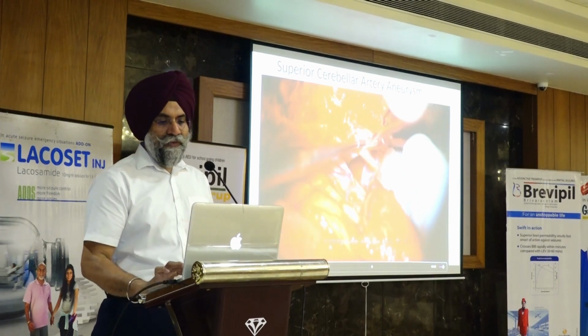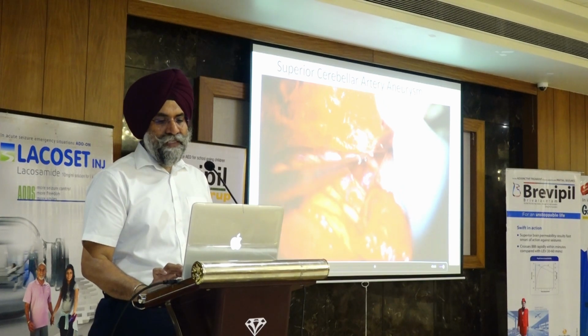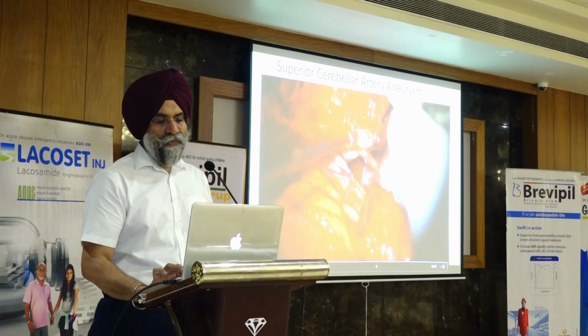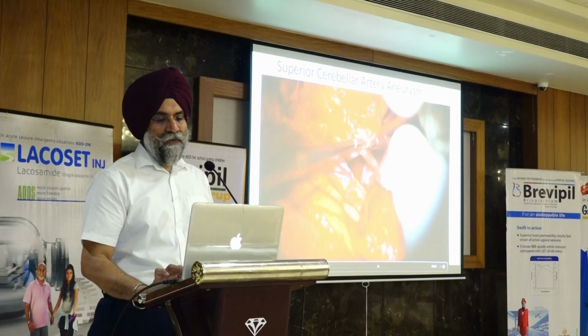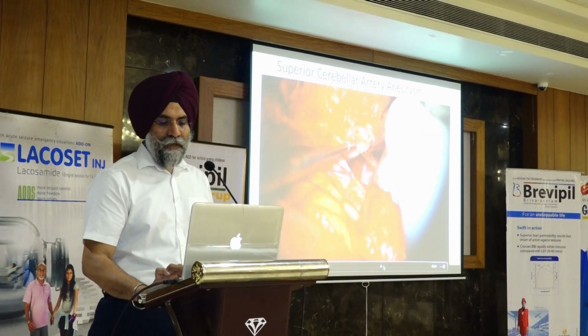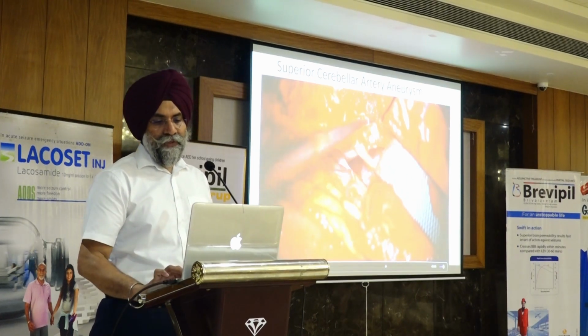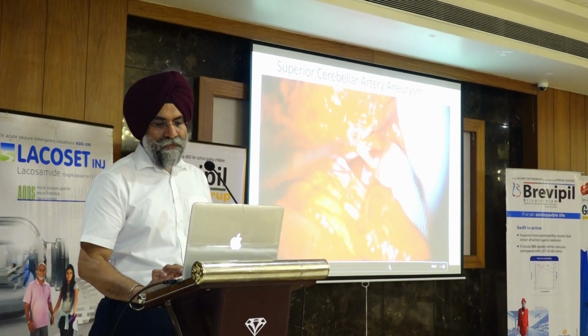Now because we don't have access to the basilar trunk as a proximal control in case of any eventuality, we are actually lengthening the third nerve. This is the cistern of the third nerve. This is the canal through which the third nerve passes through the lateral wall of the cavernous sinus. It is opened up so that we have the ability to manipulate or medialize the third nerve. So we are just extending it further.